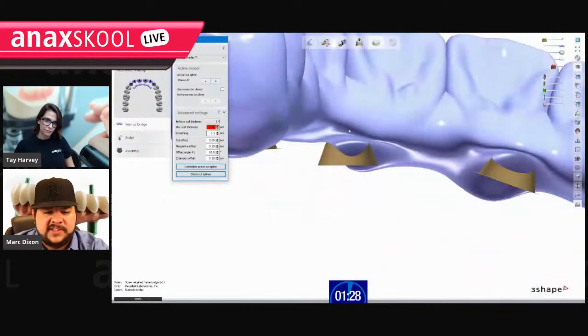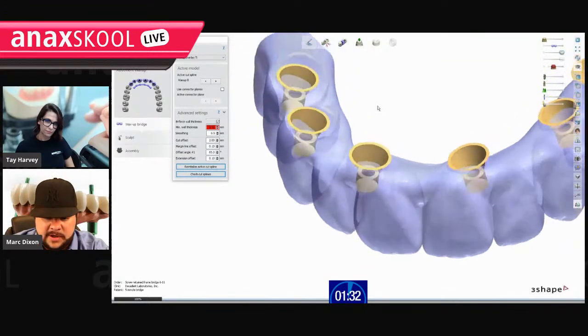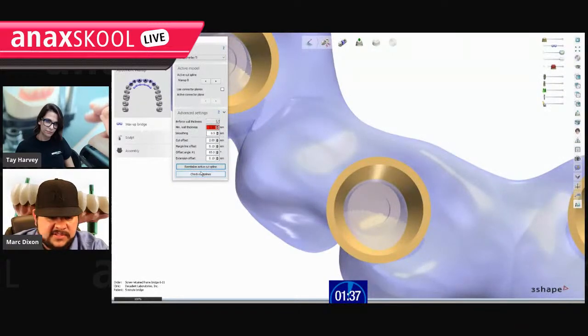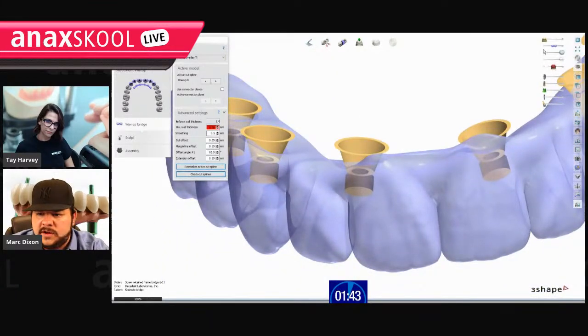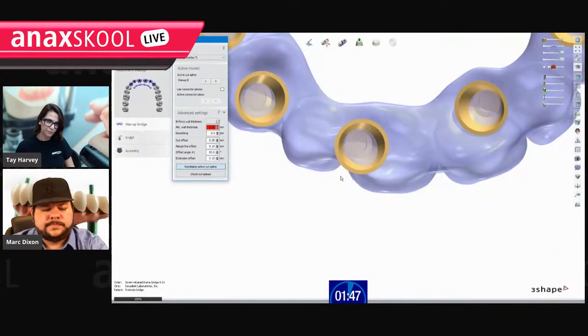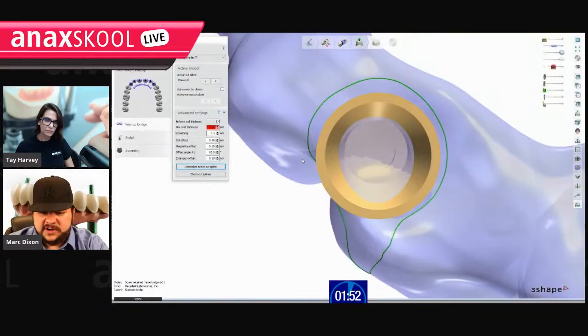You're going to just double check these splines that the software drew. If you can't see them, let's just go a little translucent or whatever. I don't even know where this one is. I don't even see it. So let's... Something's wrong. Something's not on. Let's hit reactivate that one. All right, there we go. So it doesn't always get them right, because you can see where it's going to draw over here.